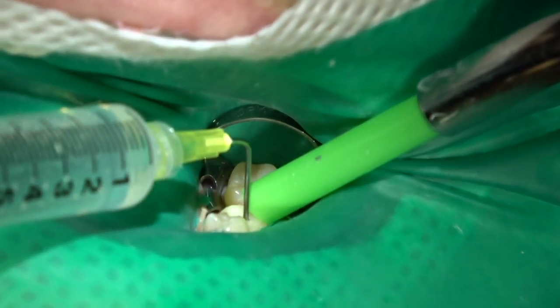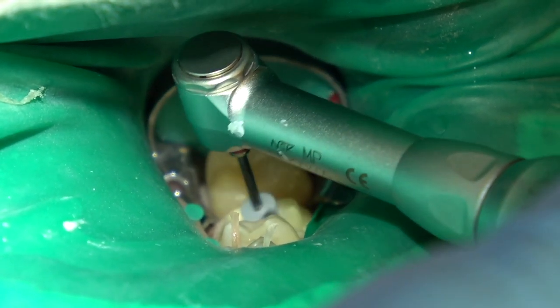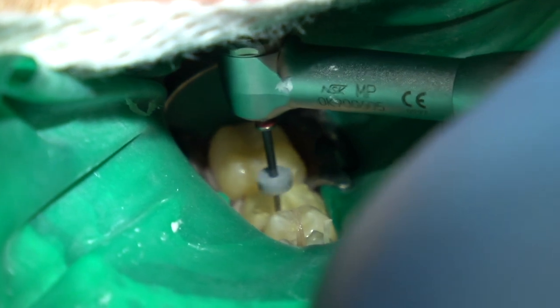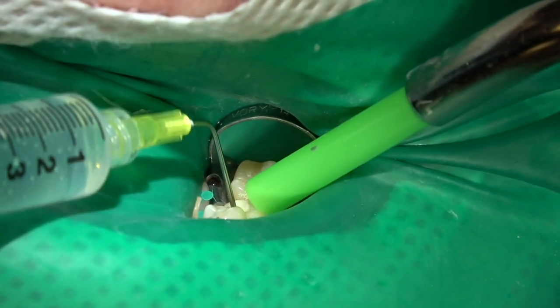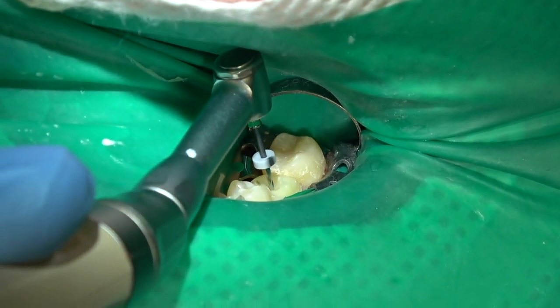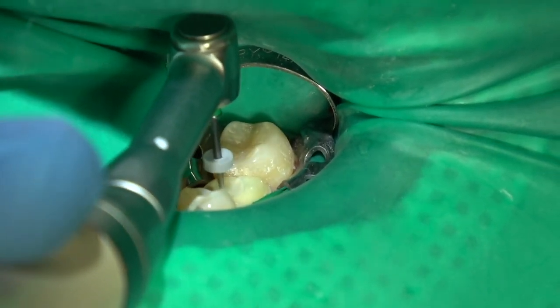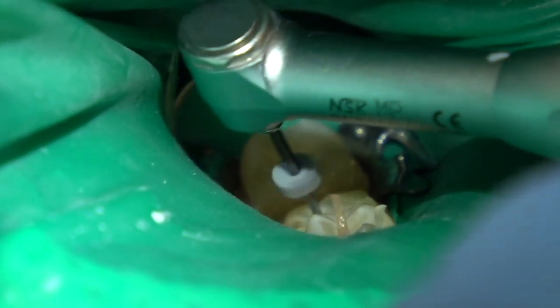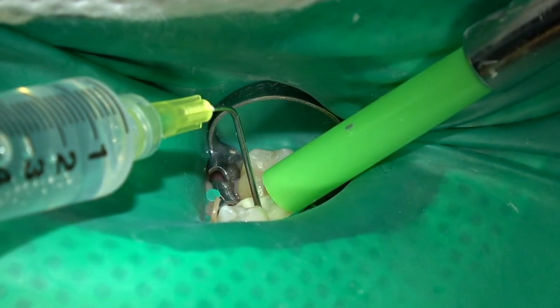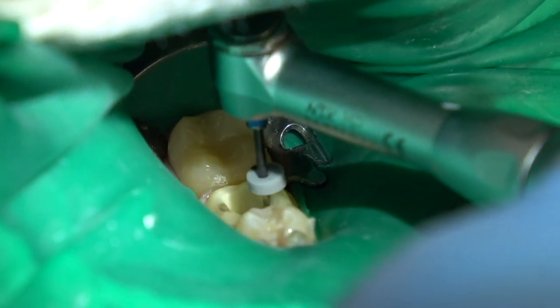And you can see I've got the stopper on there that marks my measured penetration into the canal. Now I'm with the red file, which is the 25, irrigating with my 3 parts water, 1 part sodium hypochlorite. This is the green file, which is the 35, and I don't expect it to go to depth. I'm just opening up the coronal part. See, I'm not pushing. I'm just letting it pull itself into the canal. And I'm trying to open up the coronal part so I can go to depth with one of the smaller rotary files. This is the blue one. This is the 30. And I'm not pushing, I'm just letting it pull itself into the canal.